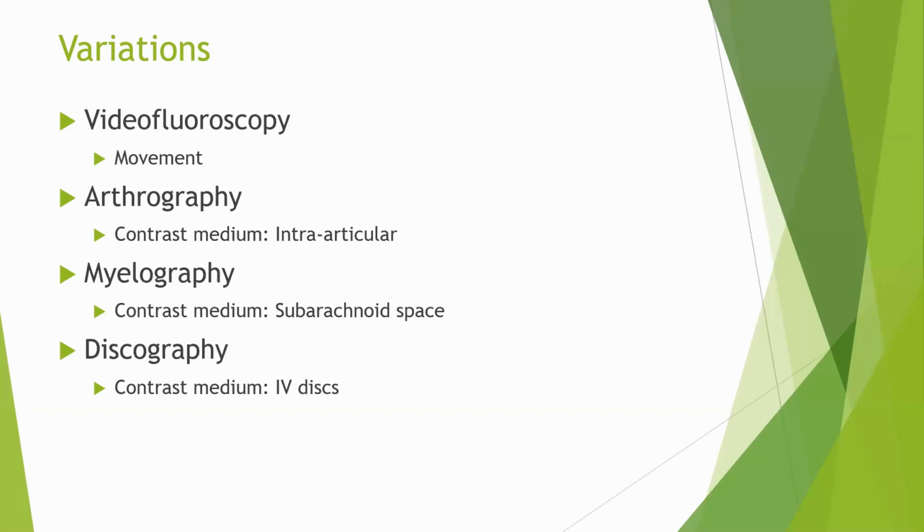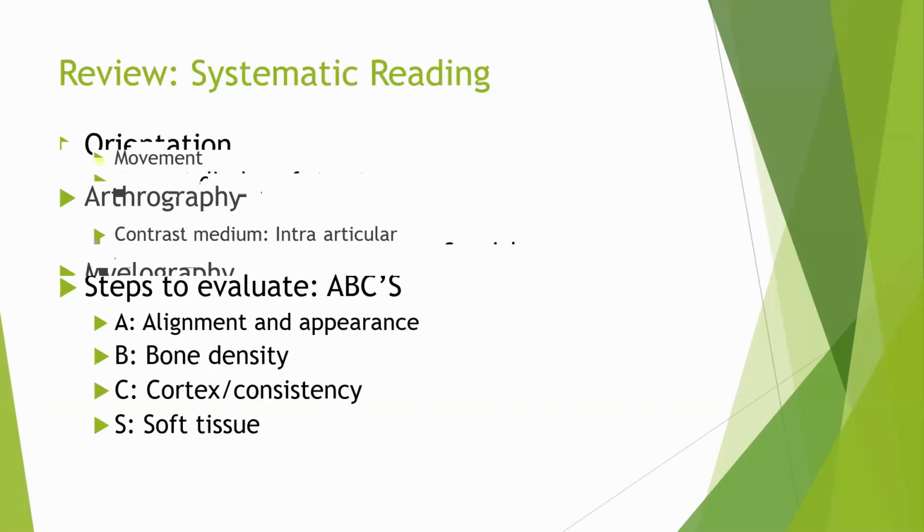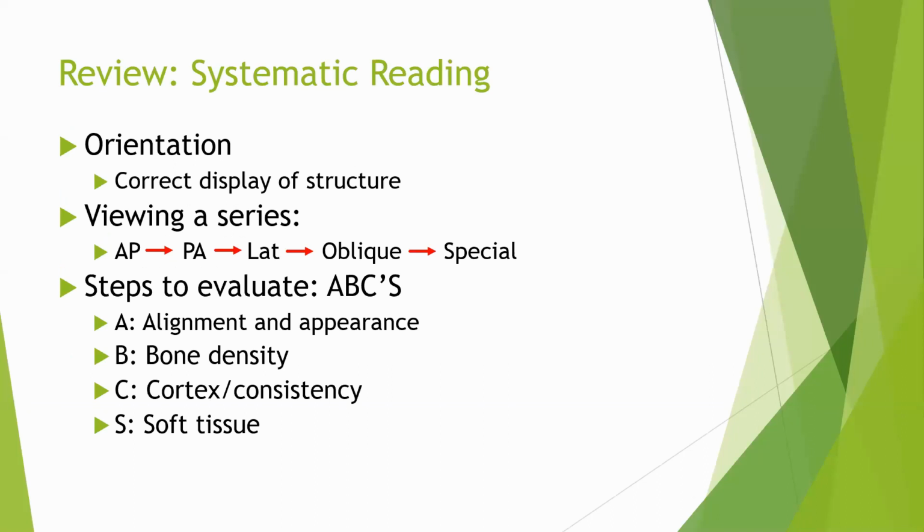But with time, with the advancement in x-rays, MRI and CT scan, less and less contrast medium is being used, because as you introduce dyes, obviously it has some side effects, and you don't want your patients to have any kind of anomalies or problems later on in life. All right, this is again a review from the basic x-rays video on my YouTube channel, and you should go and take a look.